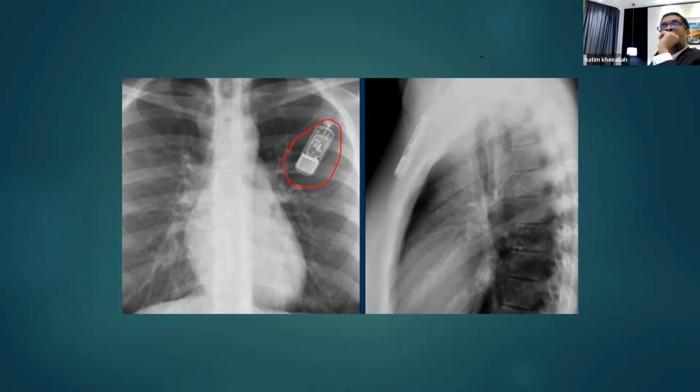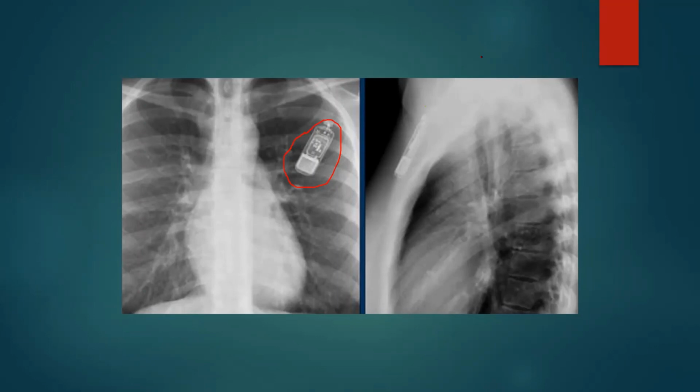So, because the device itself has limited storage memory, that's why it functions as, you know, recording and erasing, recording and erasing. And that's why, you know, the patient has a remote control, right? And you should coach the patient to press on the remote control every time he feels the palpitation or the symptoms we want to work up.